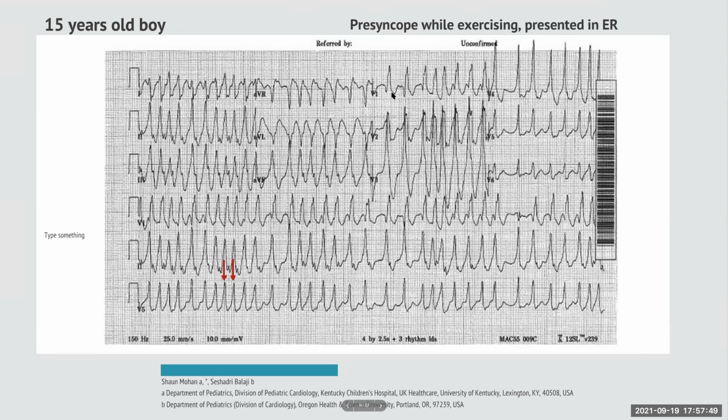or the left side of the heart, with V1 being obviously the right-sided lead, what would you say? It's going to be towards the right, because if it goes away, then that's going to be positive, isn't it? If it goes away from V1, it will be negative. Because it's coming towards V1, it has to be generating away from the right side of the heart. Okay, so it is the left side of the heart.